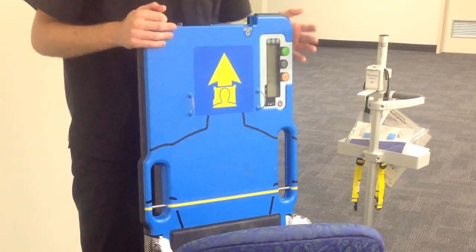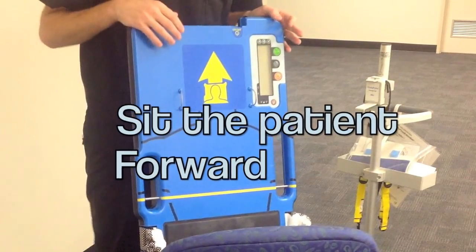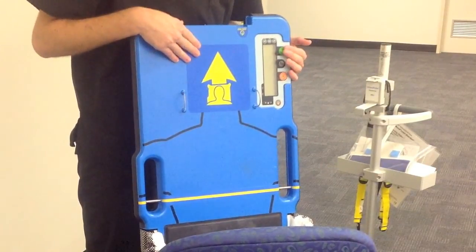To deploy the autopulse device, bring the trolley to the patient, remove the device from the trolley, sit the patient forwards and using two people deploy the device behind the patient's back, ensuring the patient's head is at the head end of the device.